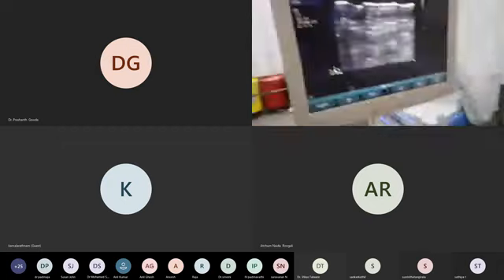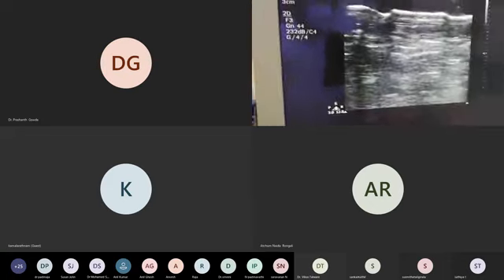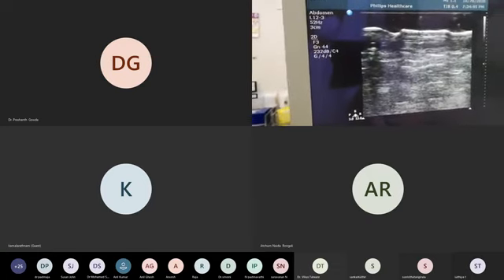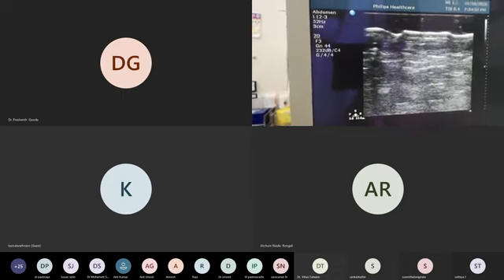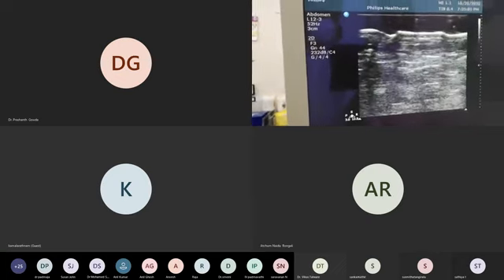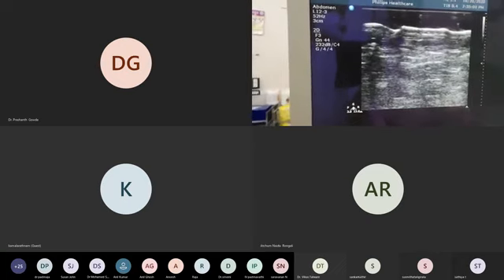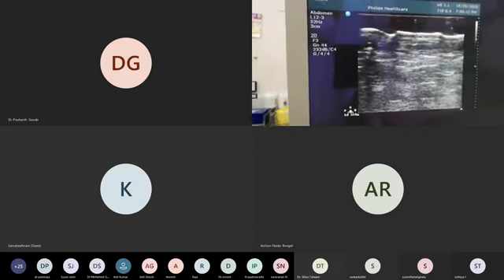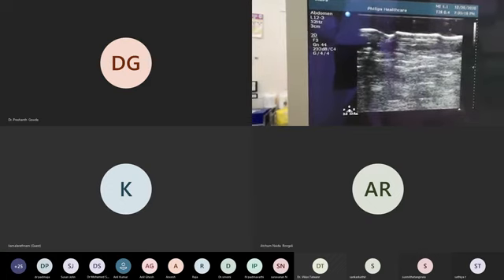So once again, I will tell you. One is tissue harmonic image. First, which mode you will see, either abdomen or, sir, can I see head? You can even choose the head because there also arteries are pulsating, but the brain won't move as the chest is moving or intestines are moving. So that is the reason use the abdominal mode. It is better, or musculoskeletal mode. That is still better. Why musculoskeletal mode is because each tissue will be moving. Each tissue will be vibrating.